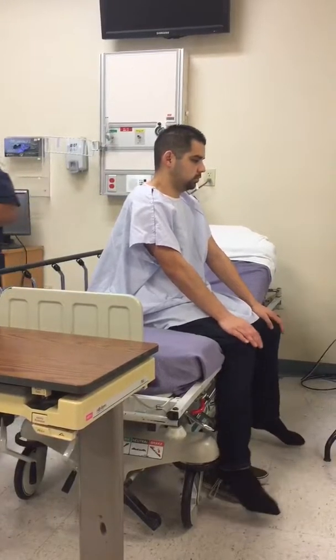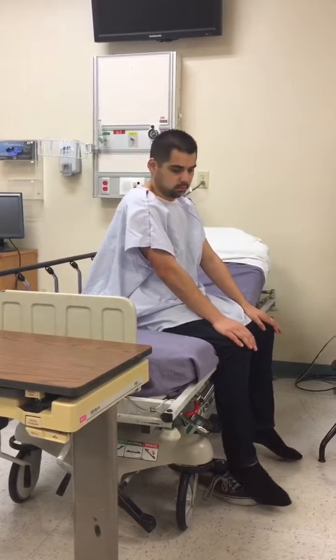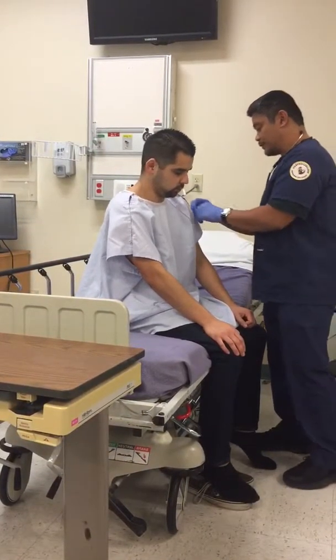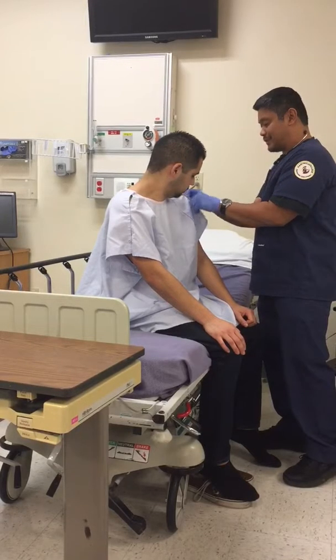So I'm going to listen to the front once again, and with your permission, let me drop it down. I'll go from this side.